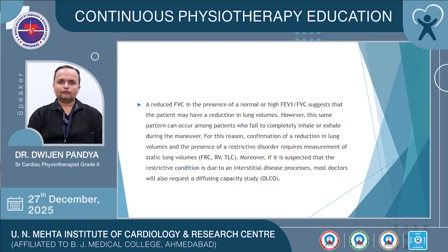For this reason, if there is a reduction in lung volume and the presence of a restrictive disorder, the doctor may suggest measurement of static lung volumes, that is the FRC, functional residual capacity, residual volume and total lung capacity. Moreover, if it is suspected that the restrictive condition is due to an interstitial disease process, most doctors will also request a diffusing capacity study.